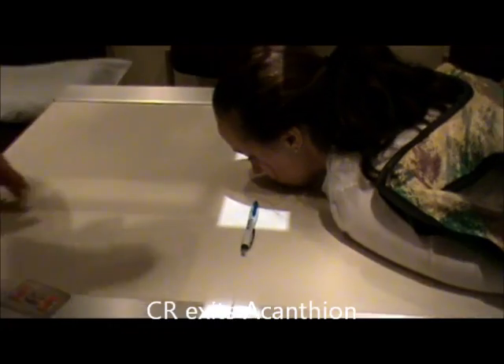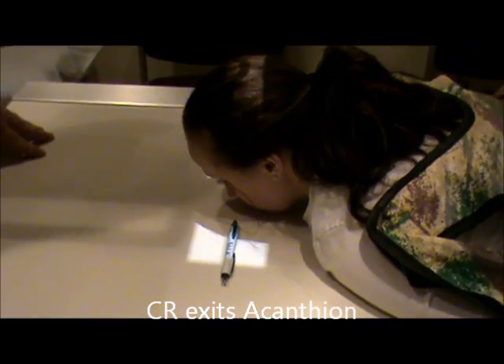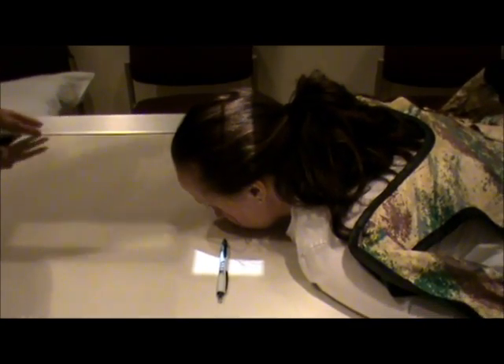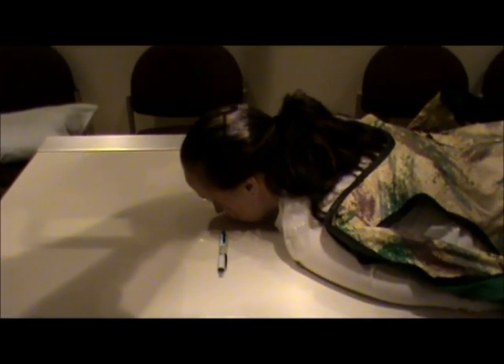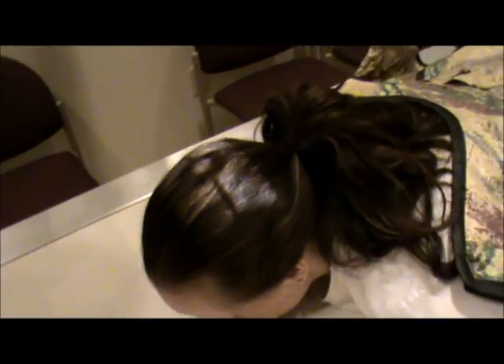Open up the collimation and center on the pin at the NSP. Collimation is going to be tight because we're only interested in what we're looking at on the Waters view — we're looking at the nasal septum, trying to see if there is any deviation.